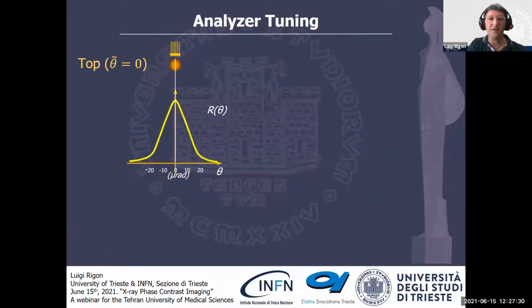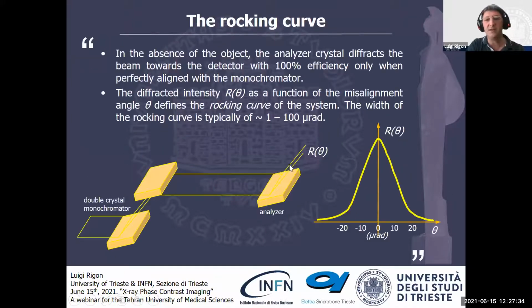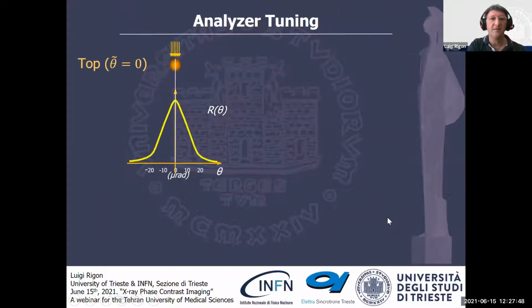According to this principle, it can be a very powerful, very effective anti-scatter grid. You reject the scattering because if you have some deviations, they will be rejected. For instance, here we have a collimated beam that impinges on the usual nylon wire.